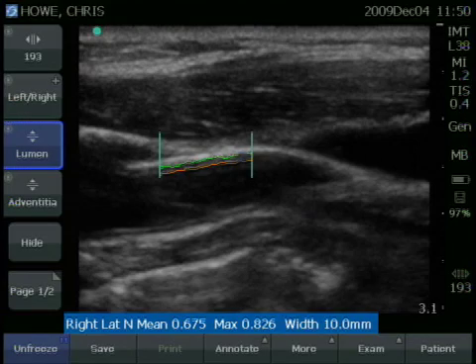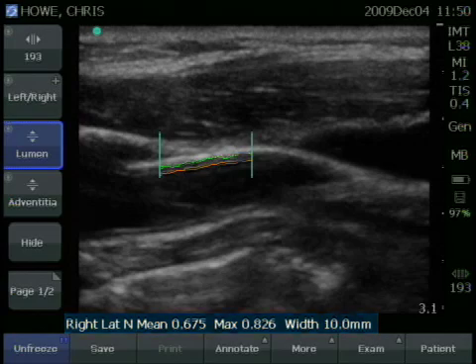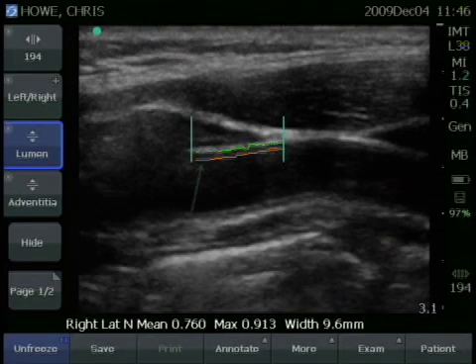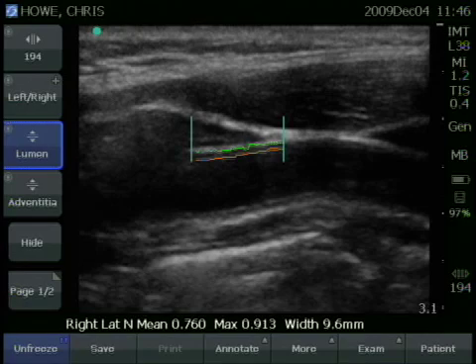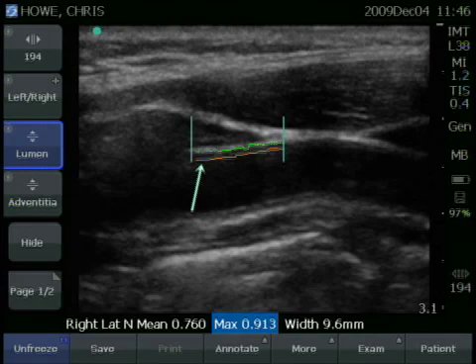On the right side — lateral — you'll see N indicating that this is a near wall measurement. When looking at the measurement, you'll notice a small portion of the measurement line is blue. That identifies the thickest portion of the measurement. The max region correlates to this blue line, representing the maximal thickness of the measurement.